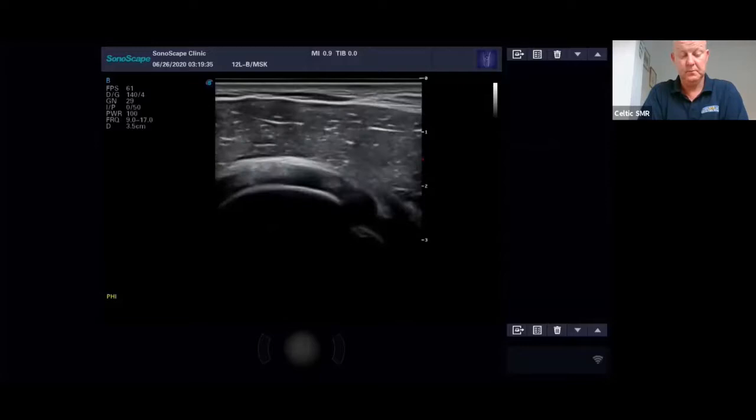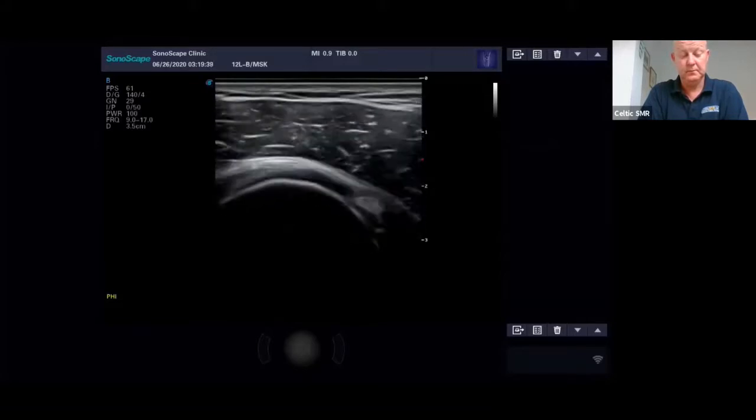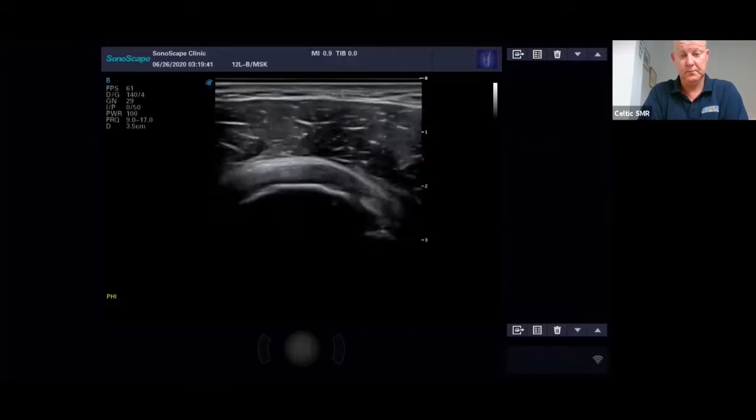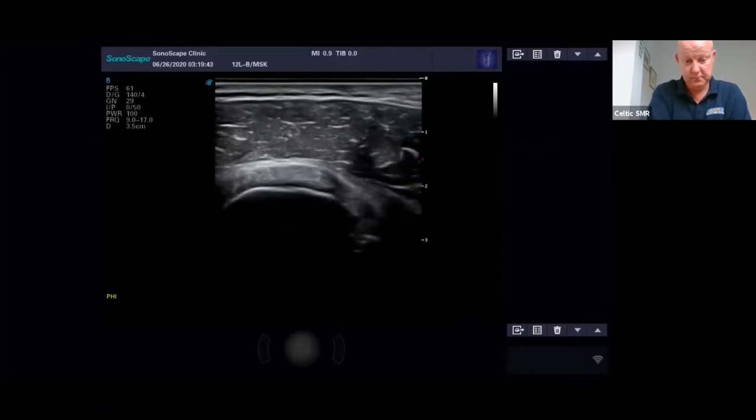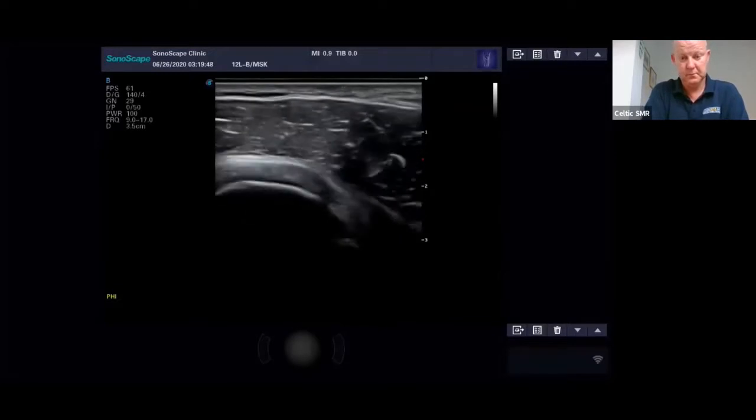You'll find you're constantly going to have to adjust your probe angle to keep the tendon bright. Your main objective is to keep the tendon bright, because when it goes dark, that could be tendinopathy or even a tear.